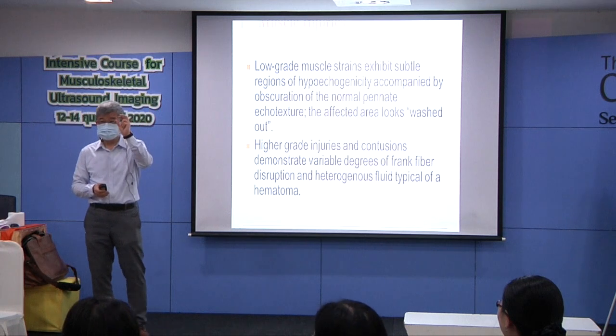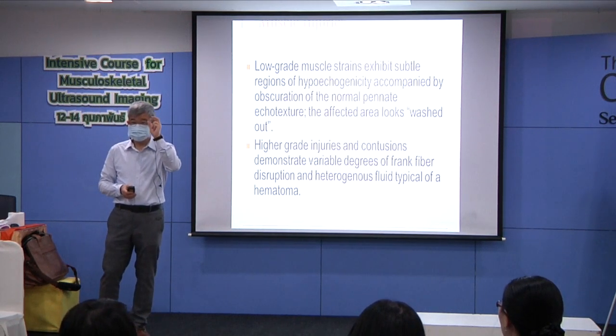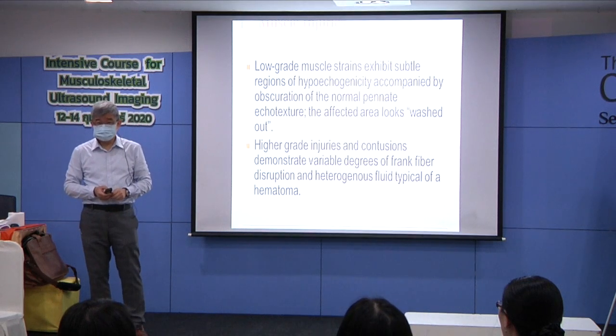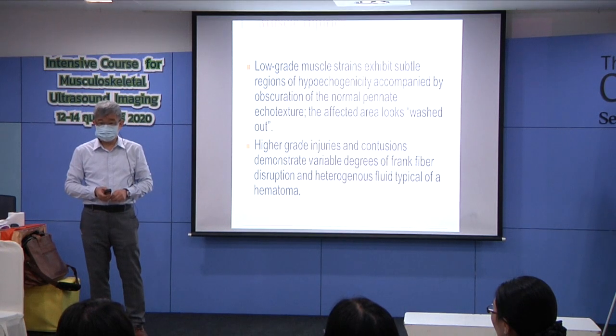Okay, tiny means tiny hypo, tiny dark, right? Tiny dark. But you say, I'm going to reduce dynamic range because you are looking for something dark, yes. But you will be very disappointed because if you reduce the dynamic range, you lose the detail.